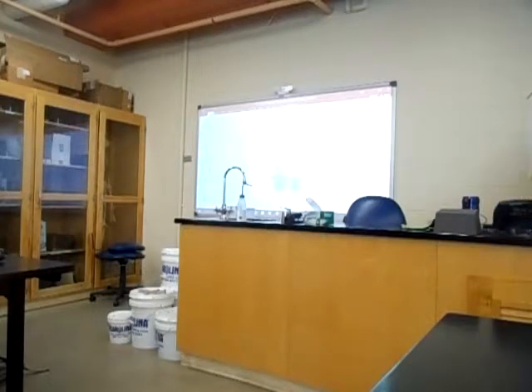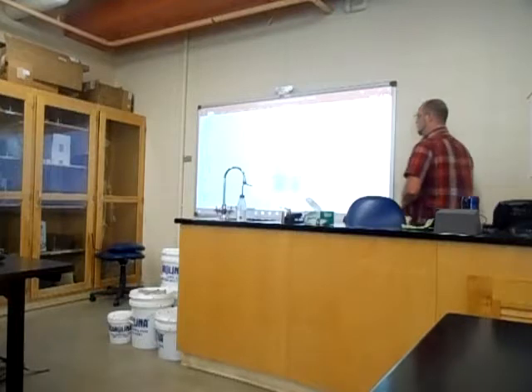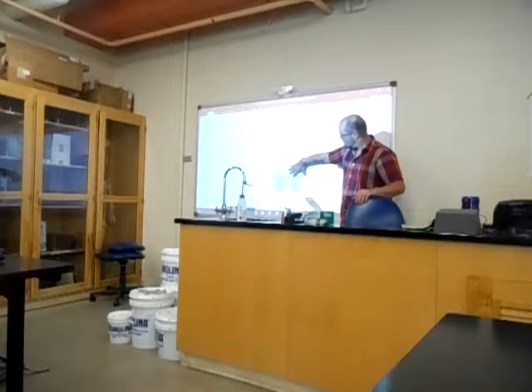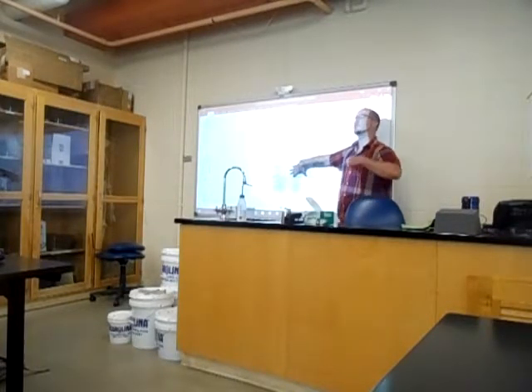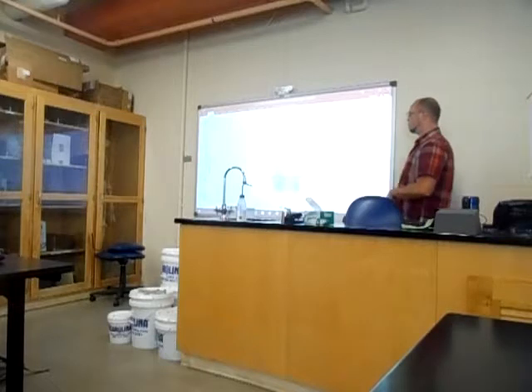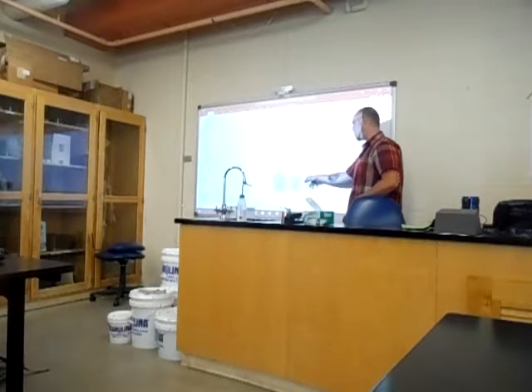I think I said earlier, one of the things you can look at to check to see if a person has had a heart attack is an elevated ST segment, meaning this will be longer than normal. It will take a greater amount of time for repolarization to occur. You might also see an inverted T wave, which means that rather than going up, it goes down.